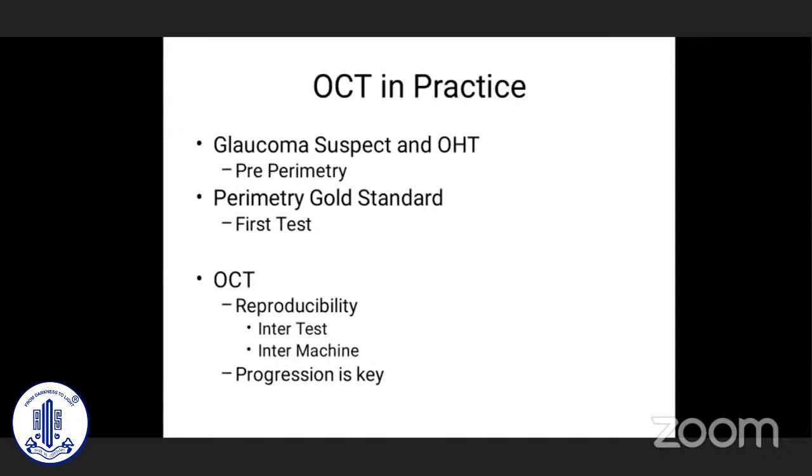This is despite the fact that in my practice, I try to do all the tests, OCT and perimetry, on my own, along with my optometrist. I stand and supervise. So a lot of errors like segmentation and others, which others may talk about today, are not there or are negligible in my practice, because I tend to stand along the test.